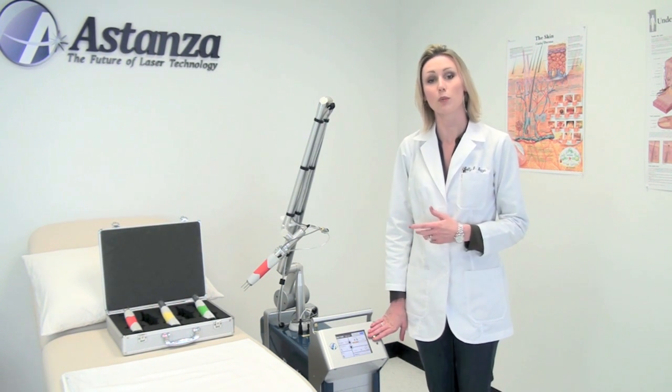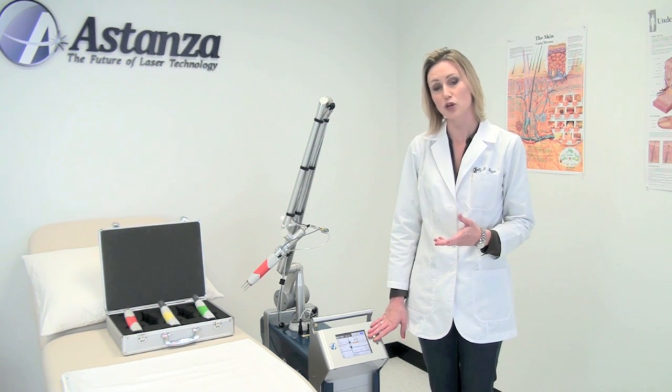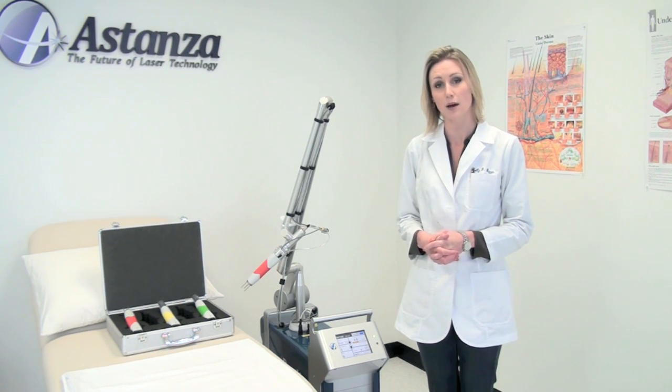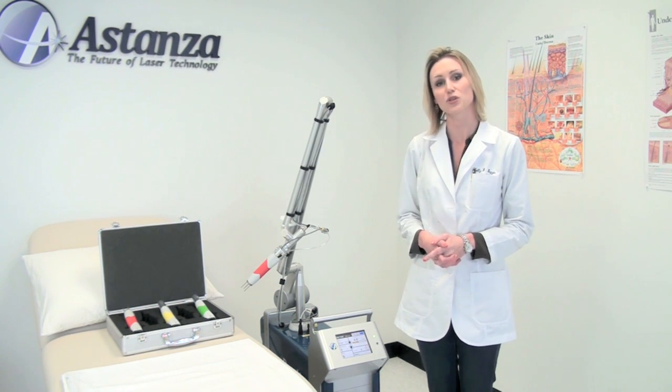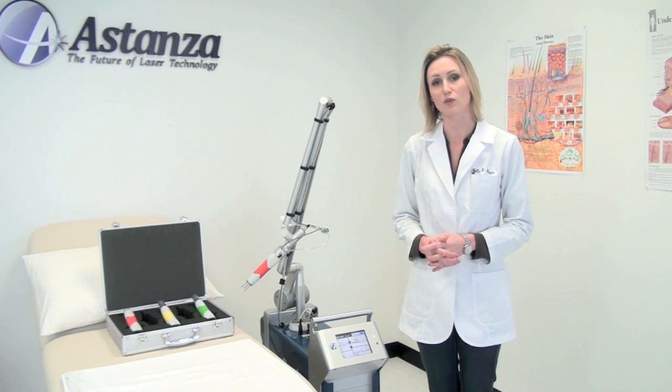Today we will be doing a couple of treatments on a variety of tattoos. We'll show you a before picture, an immediately after treatment picture, where there's that nice laser snow or laser frosting that you should expect after each treatment. And eventually we will share with you the full removal after shot, once we have removed the patient's tattoos. Thank you very much.